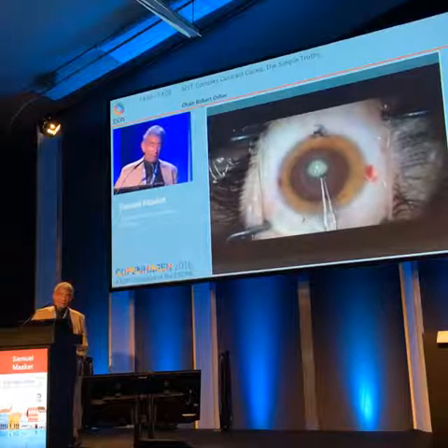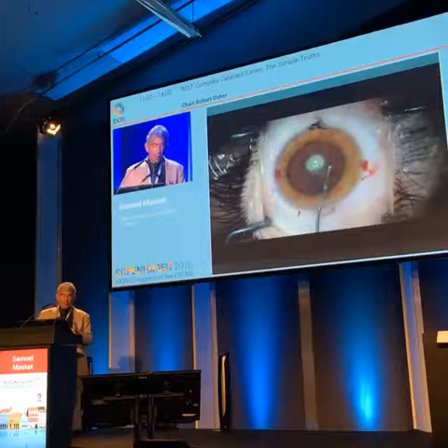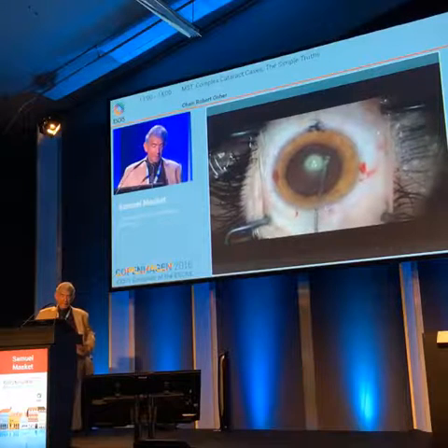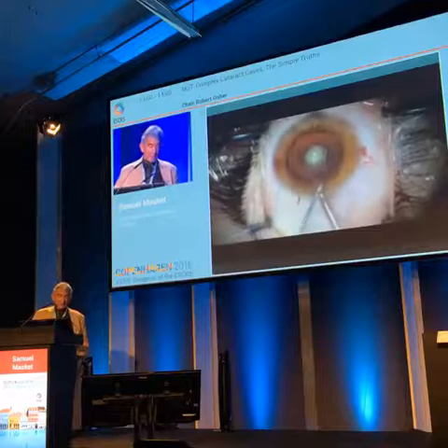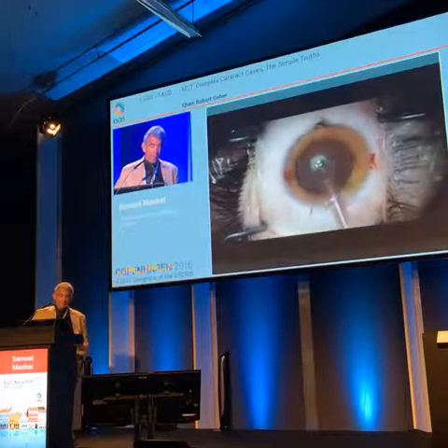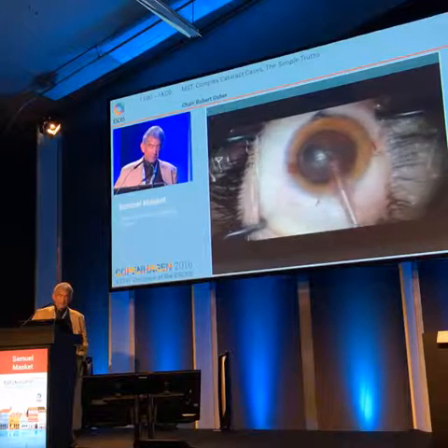I think a very strong case can be made for using femtosecond laser. In these, I don't divide the nucleus, but this gives me the capsulotomy exactly where I want it, so that if I do have a defect in the capsule, I can use the anterior capsule for capturing. This is hydrodelineation, not hydrodissection. And because she's 38, all we really have to do is aspirate the endonucleus with almost no ultrasound.